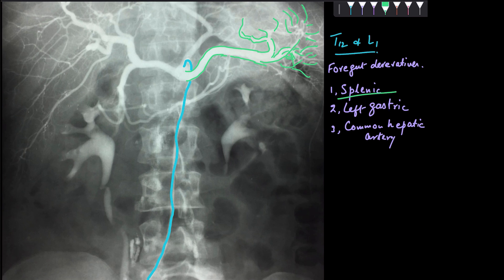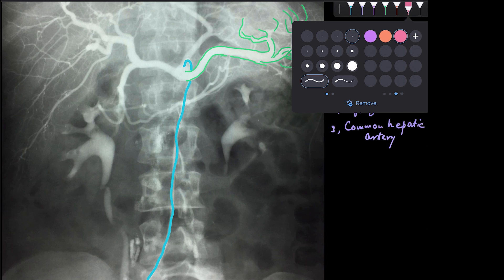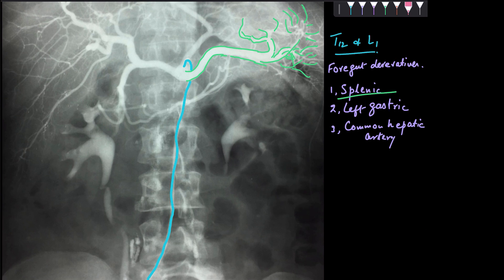After talking about the splenic artery, let's take another artery — that is my left gastric artery. You can see the left gastric artery which ascends up and is directed towards the lower esophagus. It supplies the lower esophagus and then comes down, giving multiple branches around the lesser curvature of my stomach.